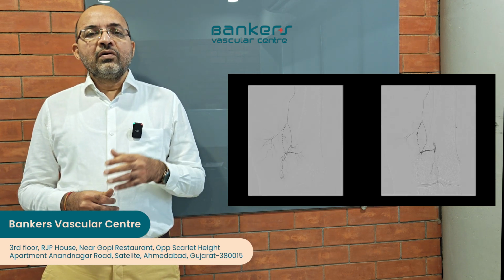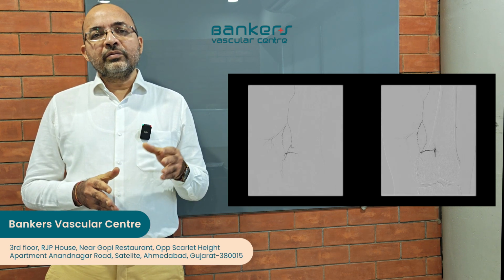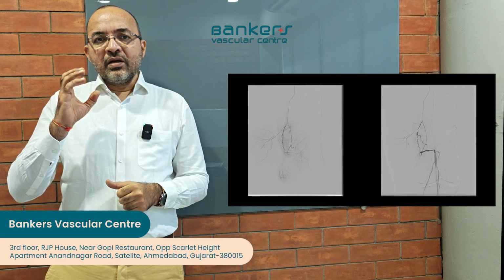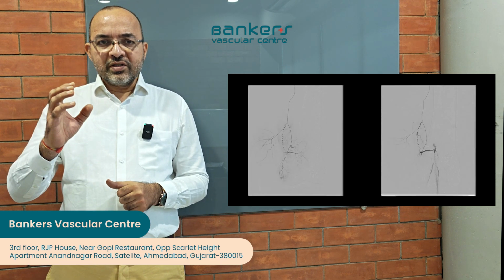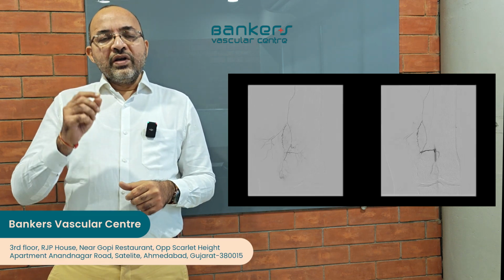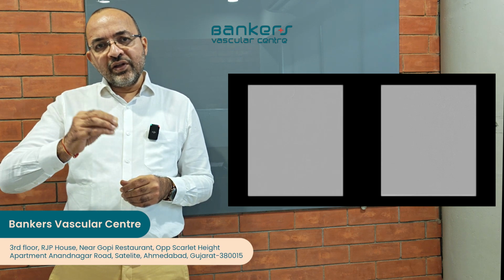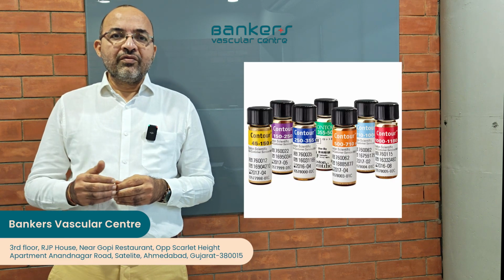In this patient also, we have done this genicular artery embolization. The patient has knee pain, and we have done the genicular artery embolization. You can see the vascular blush on the angiography. This vascular blush is the area where abnormal cytokines are released within the knee joint, and these cytokines are responsible for the chronic inflammation or arthritic changes within the knee. So we inject these small 45 micron particles, and these particles will actually stop the release of the cytokines within the joint, and that's why the inflammation reverses, arthritic changes reverse, and that's why the patient's pain will reduce.